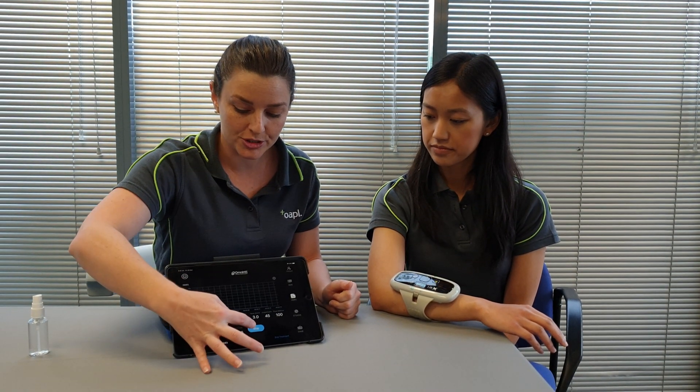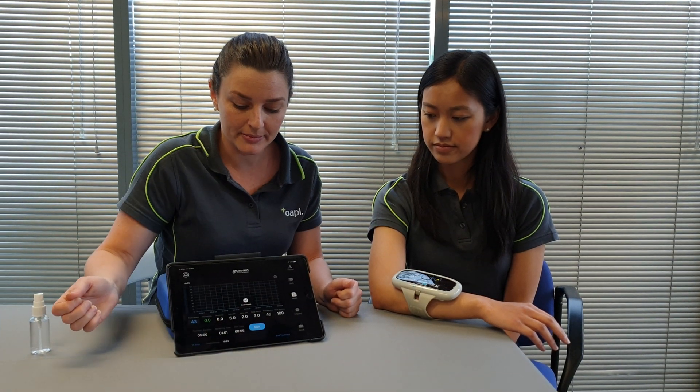What I'm going to do is start the treatment and increase the intensity of the stimulation. That's going to offer Anita wrist extension and hand extension, potentially allowing her to grasp an object or to perform daily hygiene to her hand.